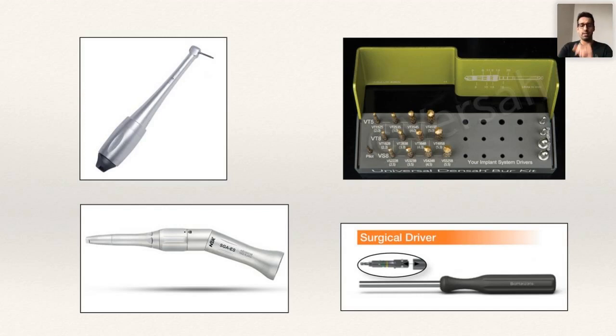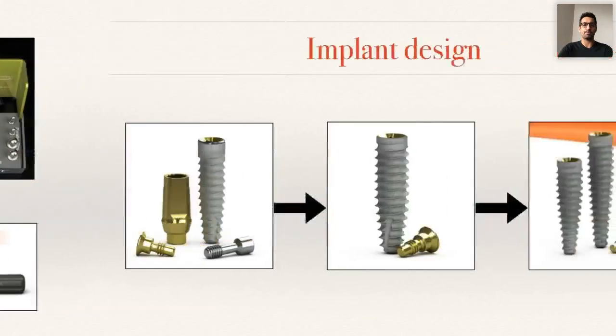And then it's really useful to have the surgical hand driver to get a feel of the implant as it's going in, and to just put it down to the right depth. So these are four essential pieces of equipment that make placement of pterygoid implants so much easier.